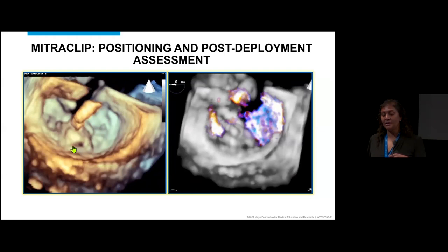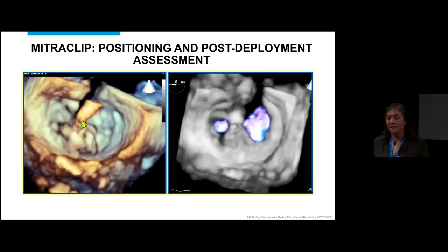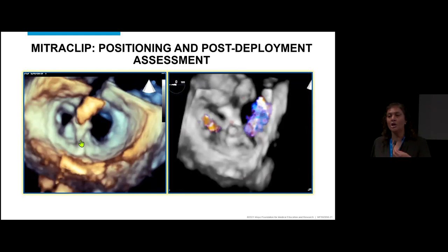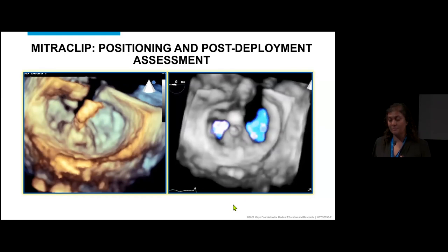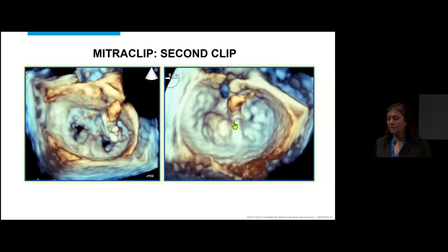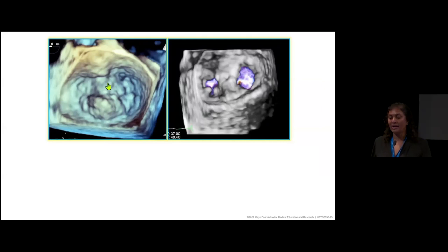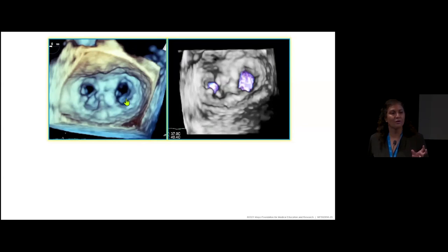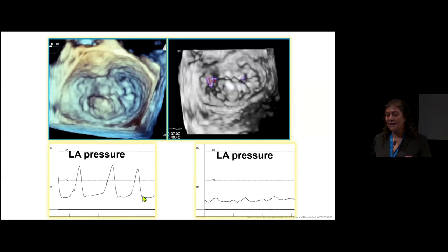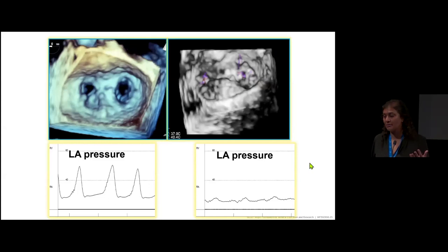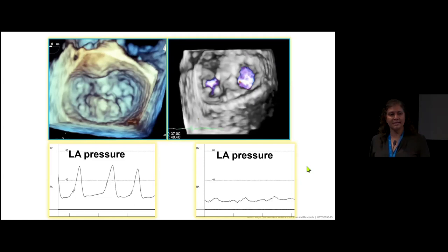For our patient, we got the anterior and posterior leaflet — we look for a tissue bridge, meaning enough of both leaflets are solidly in the clip. But there was still significant mitral regurgitation seen medially, so the decision was made to place clip number two. After deploying the second clip, we got a beautiful result with a wide tissue bridge and an owl's eye appearance — similar to what an Alfieri stitch looks like surgically. Mitral regurgitation was far less, and the V wave disappeared on LA pressure monitoring.